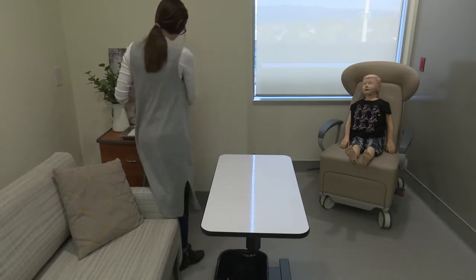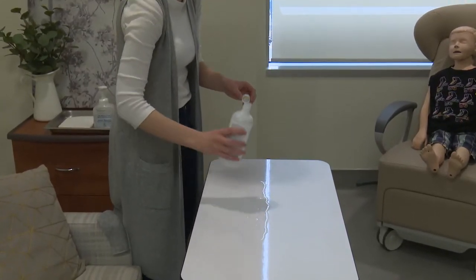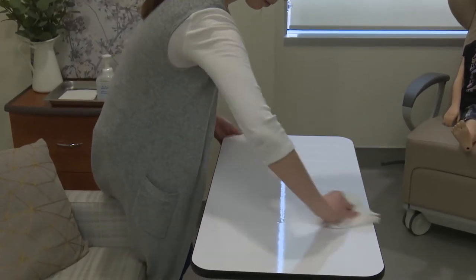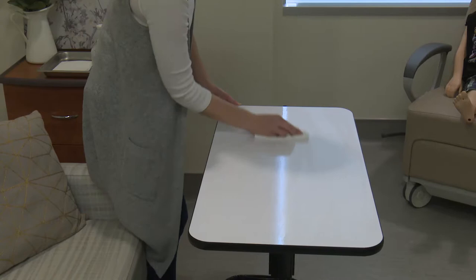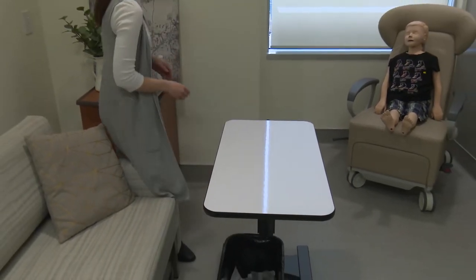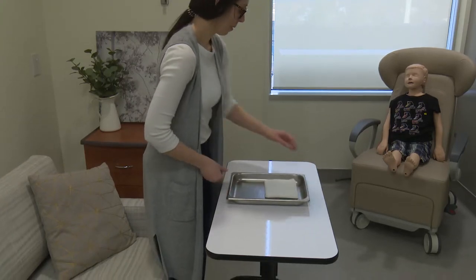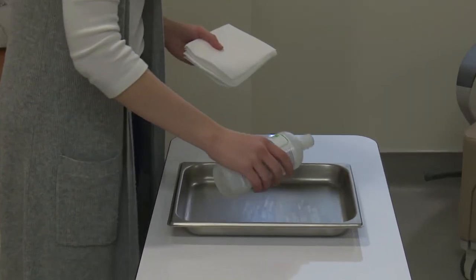Place your tray down on your countertop or table and clean your work surface with the alcohol solution. And dry with your clean paper towel or towel. Place your tray on your work surface and clean it with the alcohol solution and dry it with your paper towel.